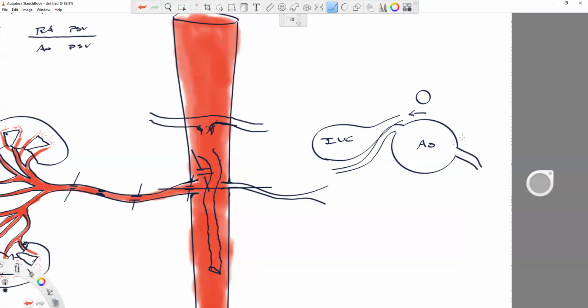And you're lucky to see that much as well. There's usually a lot of shadowing over on this side from stomach or colon. I don't need to draw in color. Obviously, this is red, this is blue, just by standard colorization. So this is what it looks like to get a proximal.